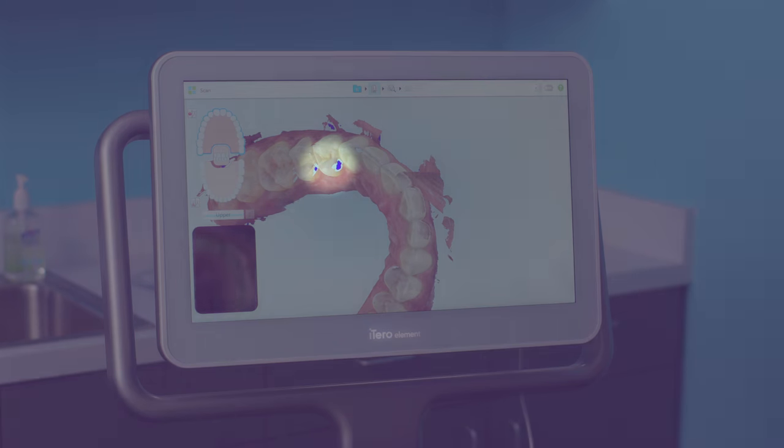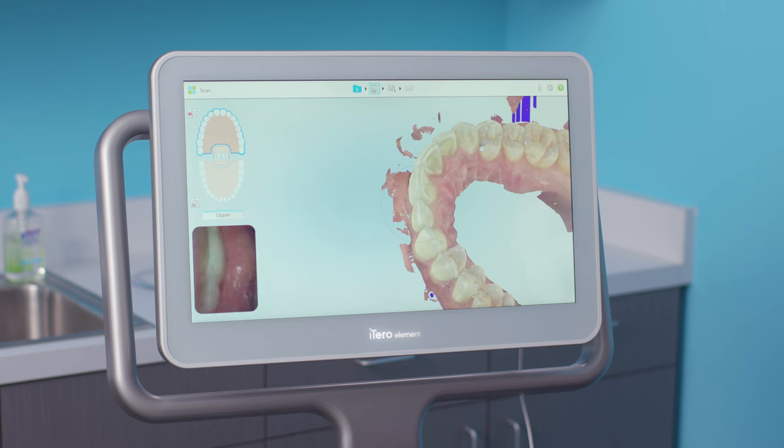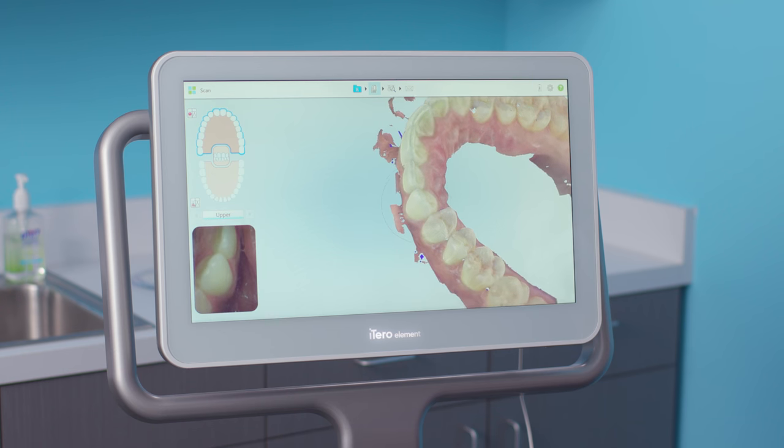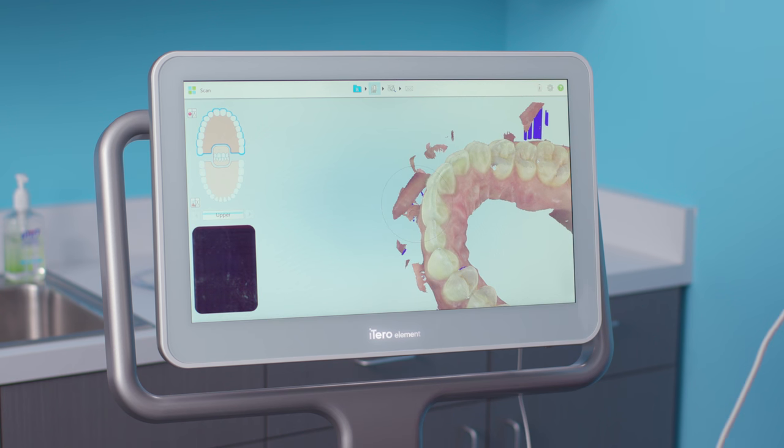I use the red and purple marks to guide me to fill areas of missing anatomy. Missing anatomy alerted by the red and purple marks needs to be filled no matter how small an area. However, holes without red or purple do not need to be filled no matter how large.